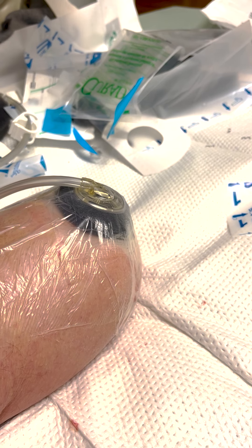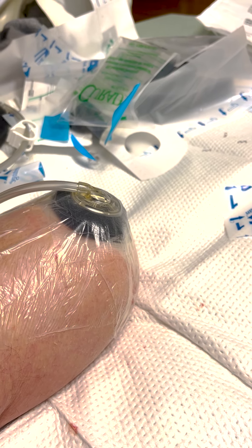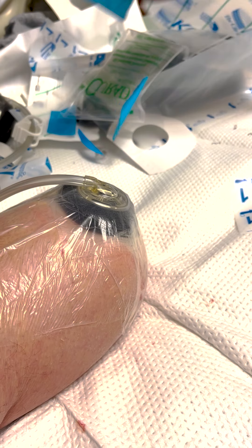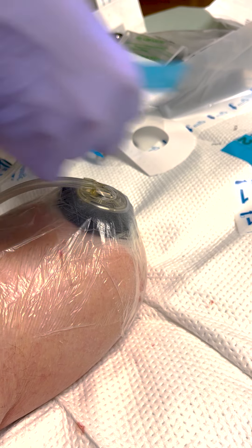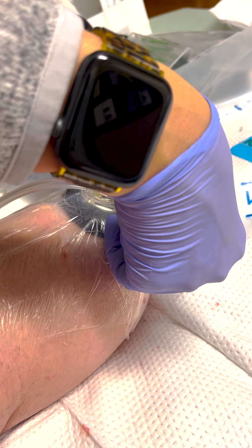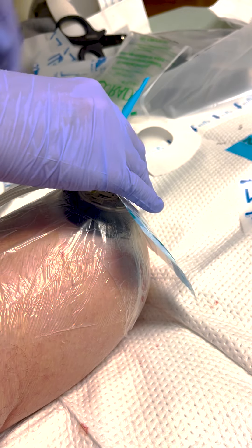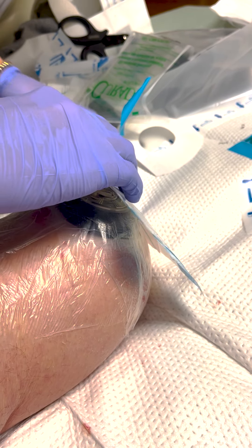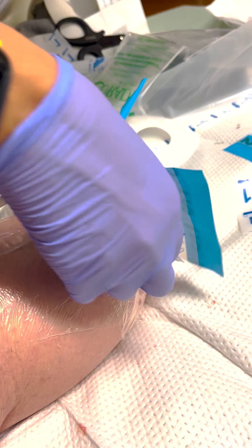That was close to being ready here. It's not an exact science — I found that out. I thought when I did this the first time it would have to be done exactly right, but it's more of an art form. More arts and crafts. Arts and crafts — you're right, you said that the other day. Whatever works, works.